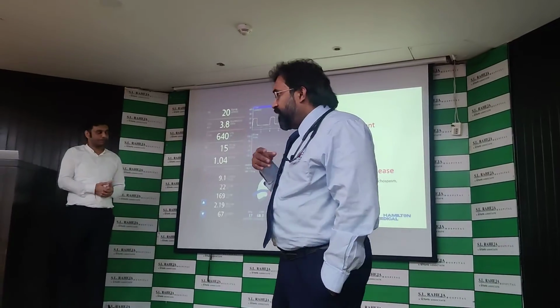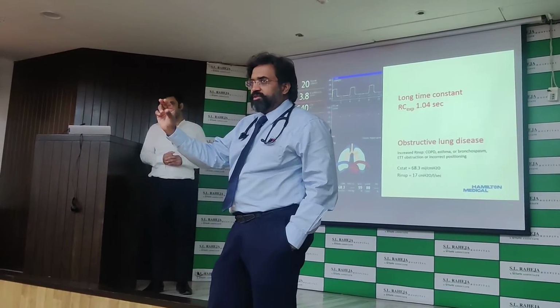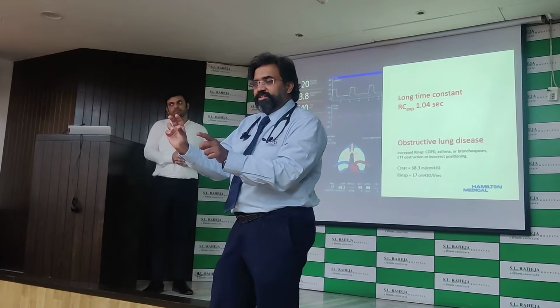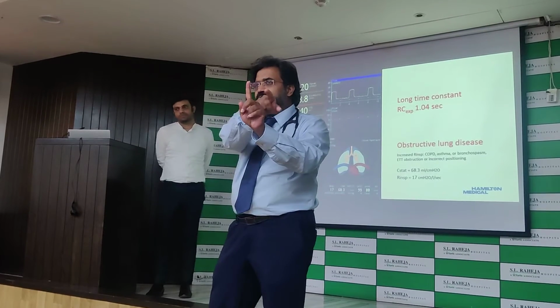So each alveoli has got a different time constant. So there will be one alveoli that is so big, there will be one that is so small. This alveoli's time constant is different, this alveoli's time constant is different. When I am pressing plateau pressure, what am I doing? I am stopping the flow. When I stop the flow, I have to monitor my pressure from here.